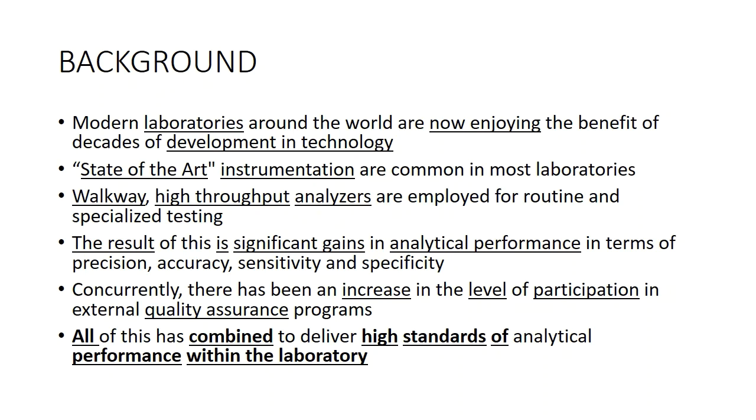And what is the impact of this? The laboratories are very sound, very capable at the analytical phase. The chance of errors is decreasing day by day because we are also running commercial quality control. There are many alternative performance assessments like inter-laboratory comparison. We have split testing, blind testing, retained testing, replicate testing. There are many things, right? Commercial ILCs, external proficiency testing are there, good quality machines are there. So the chance of error in this analytical phase is very, very less.